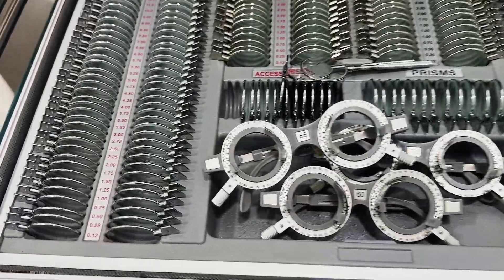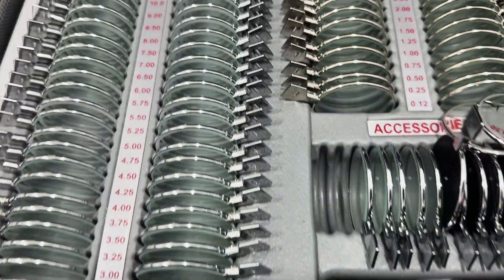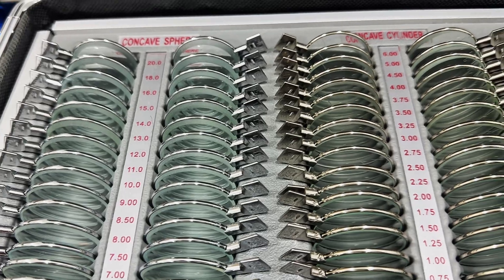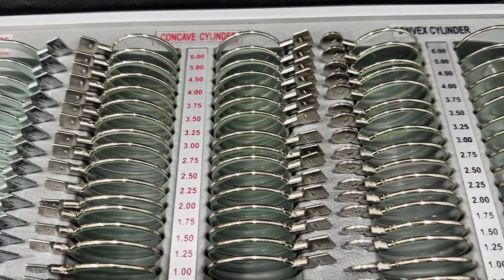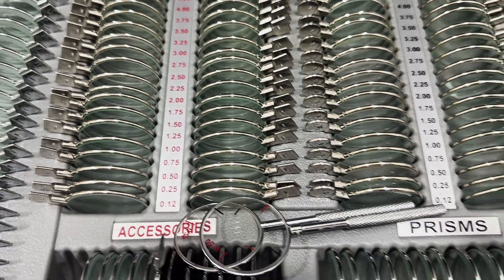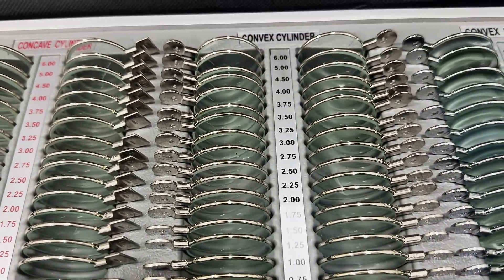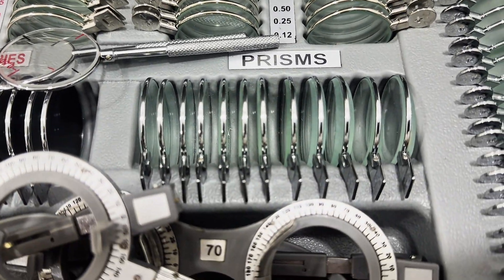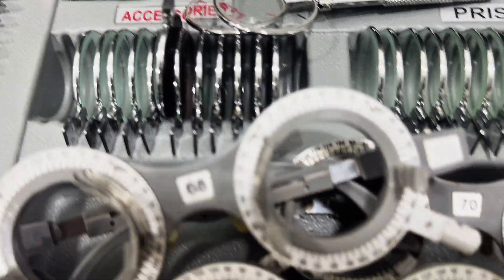Let's look at the core components. These lenses are grouped by function. We have the spherical lenses, used to correct myopia and hyperopia. We also have the cylindrical lenses, which are used to correct astigmatism. Then we have prisms and accessories, and we also have the trial frame.